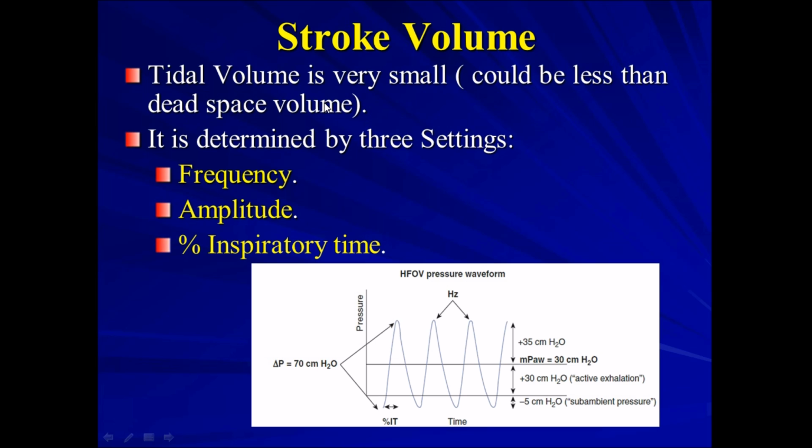So tidal volume is very small, could be less than dead space, as we said. It's determined by 3 settings. These 3 settings decide how much tidal volume is applied: the frequency we choose, the amplitude we choose, and the inspiratory time percentage.